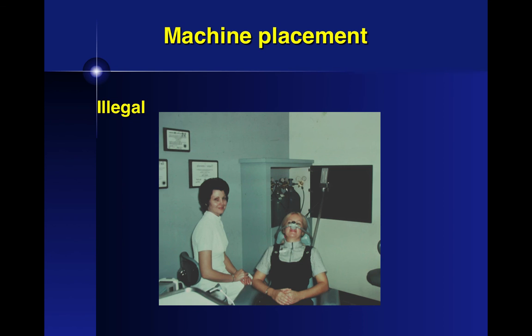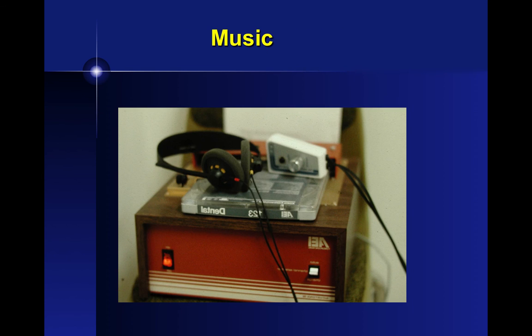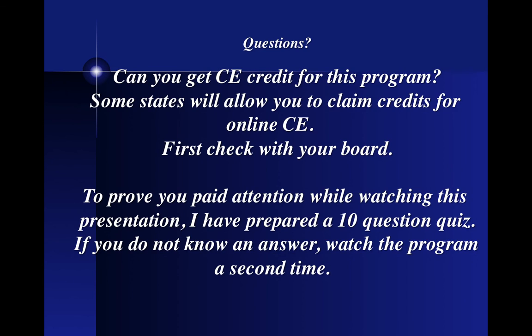They didn't have a regular installation for the gas, so the carpenter built a nice cabinet that the oxygen and the nitrous went in, and here's the machine mounted here. If you weren't using it, you just closed it. Heaven forbid if you ever got a fire in the office, the firemen are in trying to put out the fire and one of these tanks goes off. So that's illegal. They wouldn't let you get by with that today. And the ultimate trip to the dental office is some nitrous oxide and some music through the earphones.